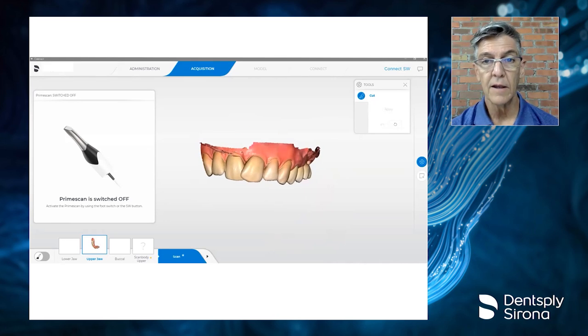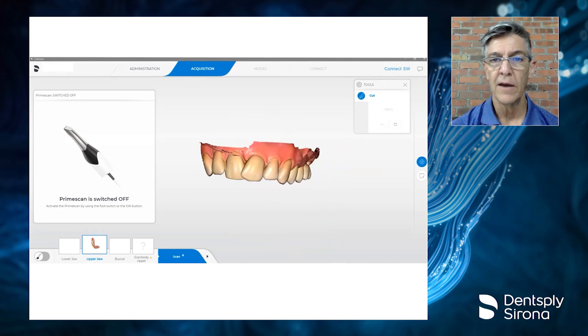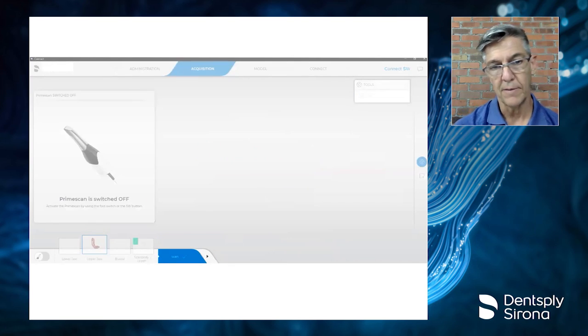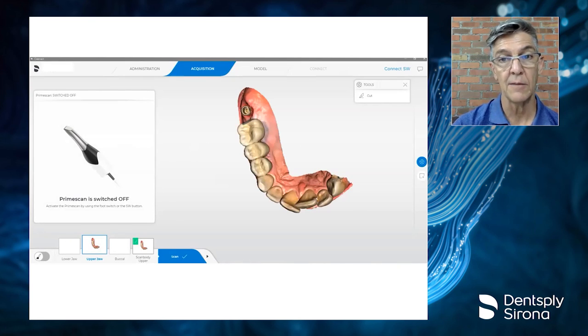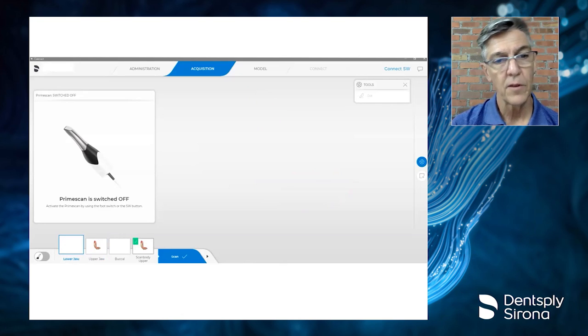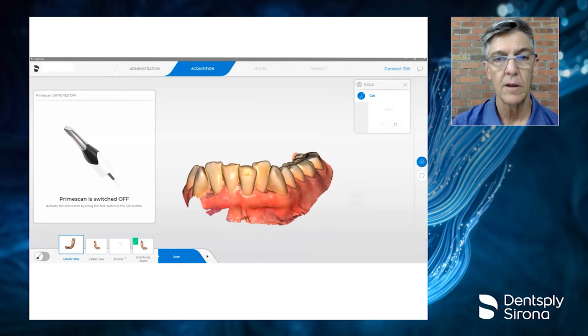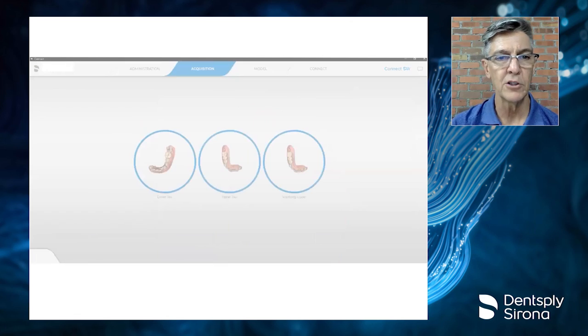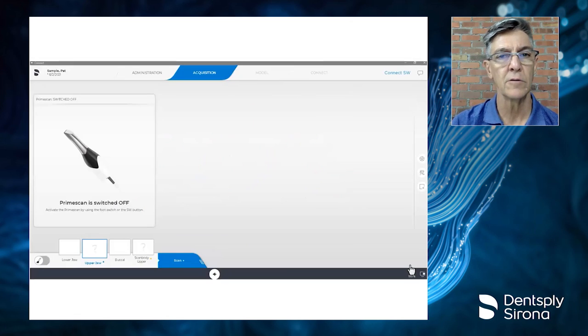Once done, then I now have my completed scan, and I'm going to take this and drag the image into the scan body box, and I'm going to hit copy. And that's going to copy the exact scan into the scan body box. Next up, we're going to scan the opposing. Once that's completed, we're going to scan the patient's bite. Once the bite is completed and we get our checkbox, we are ready to go on to the process. So that is the basics of scanning. Now, I just want to walk through this a little more carefully.